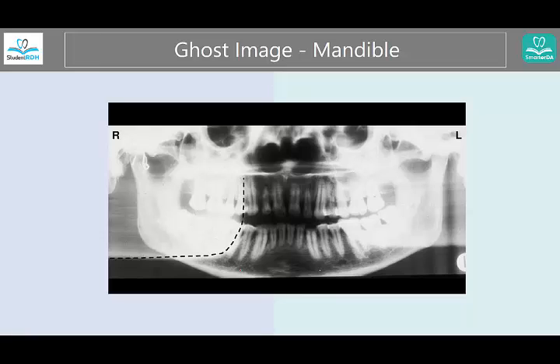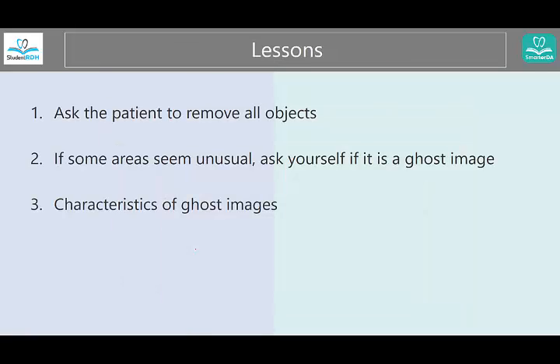Ghost images are not just about earrings — they're also about oral structures. Can you see this? This is the mandible, the angle of the mandible, and this is the ghost image of the same structure: higher up, blurry, and on the opposite side.